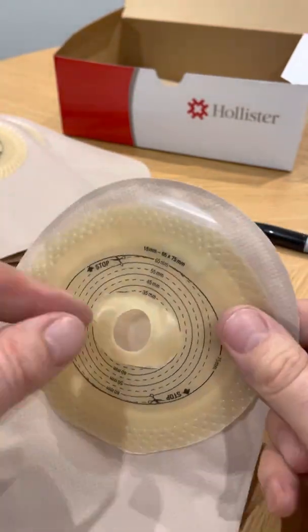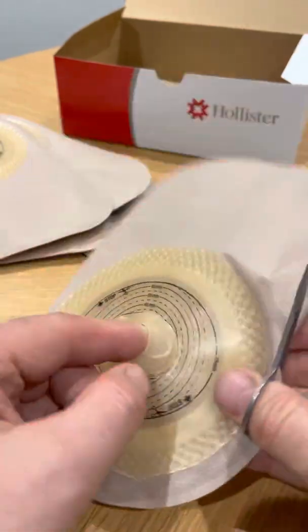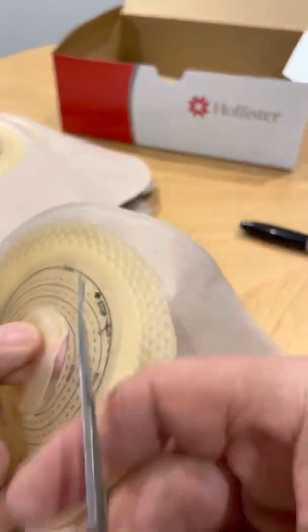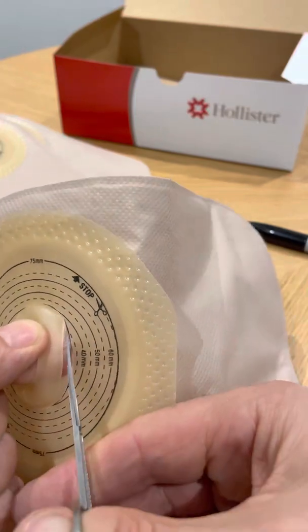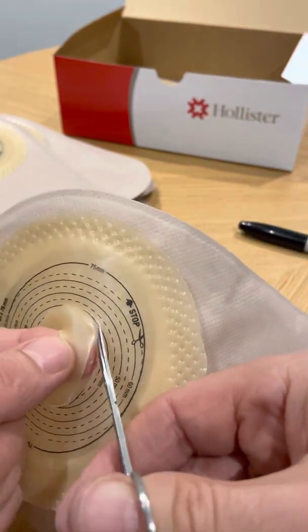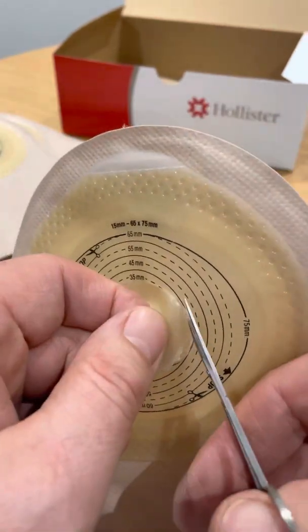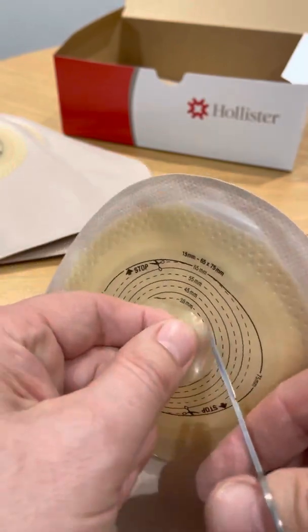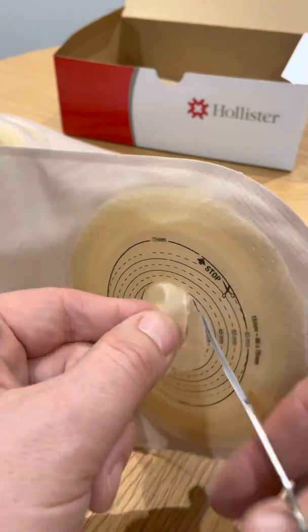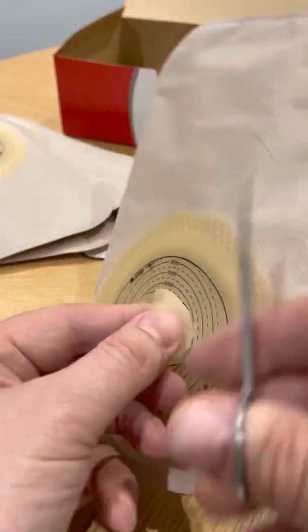Once you've done that, you can easily take your pair of eyebrow scissors, and you can easily, using your finger to make sure you don't go all the way through, just puncture a little hole in this very flimsy membrane that's left, and just cut around that. It's extremely easy, much easier than trying to cut through the whole of the thickness of the material. It really is just like cutting a very thin membrane.